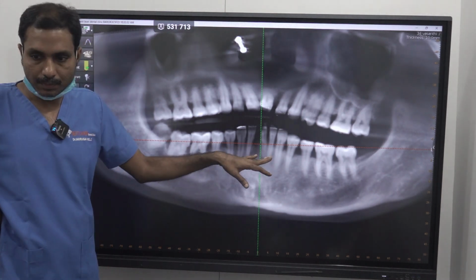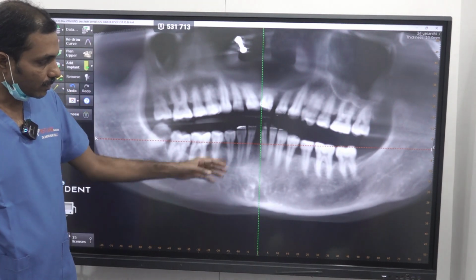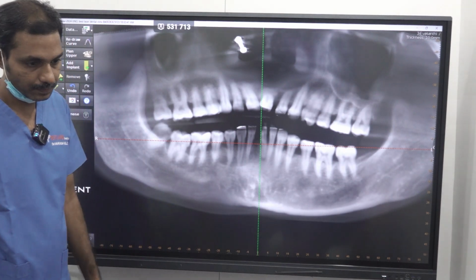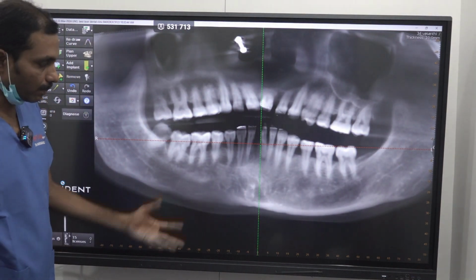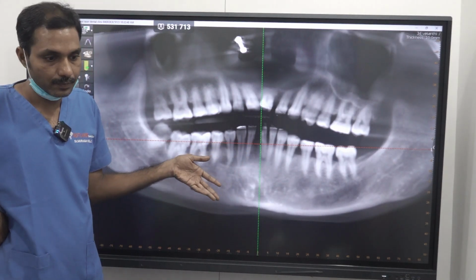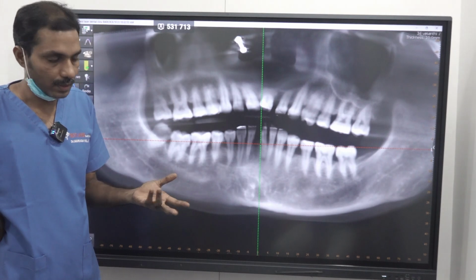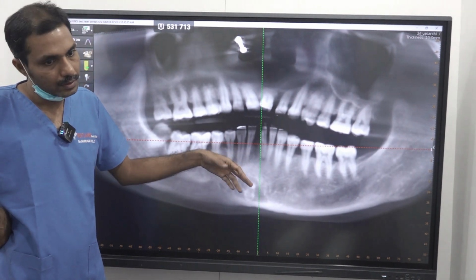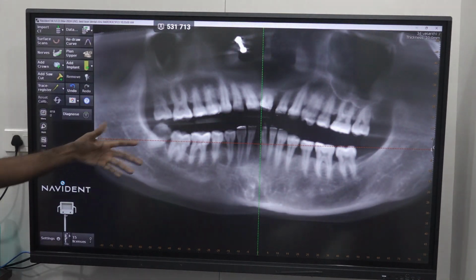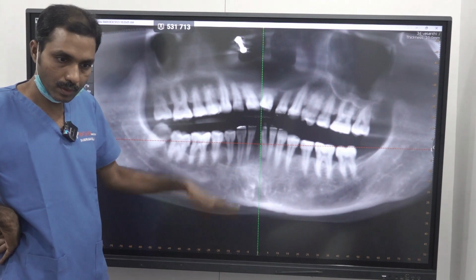Do we need to open the flap? No. No need. There is nothing. It is not necessary. What implant will you select? Compressive or basal? Both implants are possible. After extraction, check the labial plate. If it is intact, you can place a compressive implant. If there is a labial bone defect, better place a basal implant. So that can be decided only during extraction.